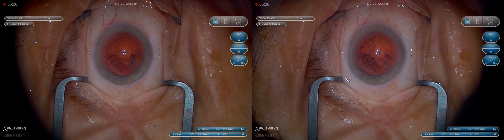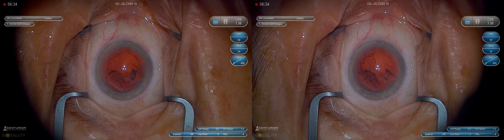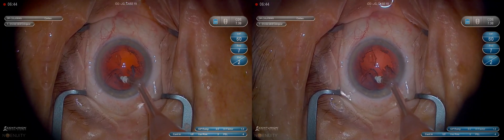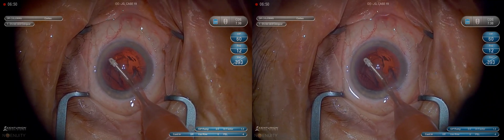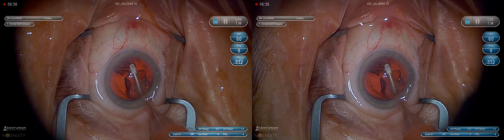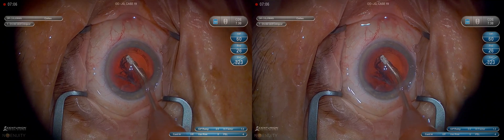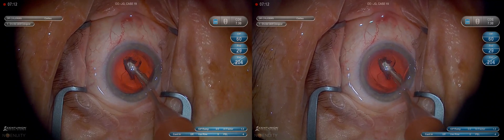Now for cortical removal, it's important to remember to move in an arc. We don't want to just pull centrally, because that puts more stress on individual zonules. If you move in an arc and you have someone with pseudoexfoliation or weak zonules for other reasons, it's less likely to cause them to tear and vitreous to prolapse around the capsule. I also like to, once I've engaged the cortex, push down or posterior slightly to create almost a U-shaped motion — engage it by moving in an arc, then add foot pedal as we move down and peel it away from the anterior capsule before we pull it centrally. That subtle little movement makes it a lot easier to get cortex efficiently and pull it in the direction of most mechanical advantage.